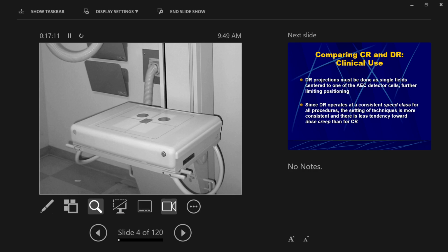I know you don't set your exposure times on your phones anymore, but you can on some, and your phone's doing it for you, right? But you have to set the right exposure time. You have to make sure the exposure lasts for the right amount of time on a picture. In X-ray, you make your own light. You're not using the light outside in the world, like cameras do. You make your own light. You have to decide how much light to make, right? How much X-rays to make, how much radiation to create, and how long to make the exposure last. With AEC, it does it for you. You just press expose. And the machine, the software and hardware, work together to decide when the exposure should stop, when the right amount of exposure has been reached.